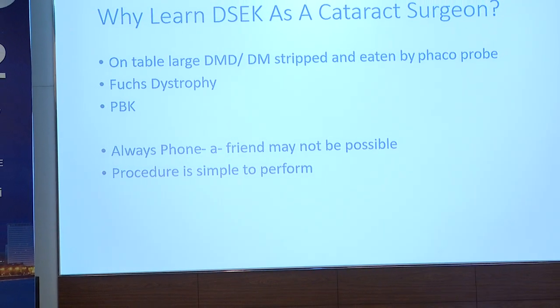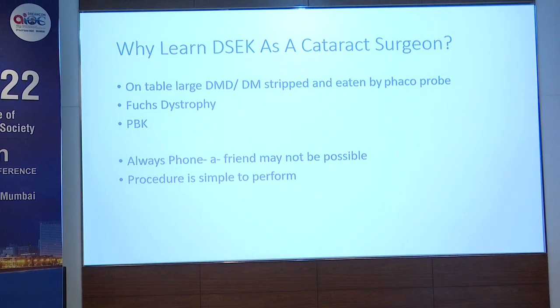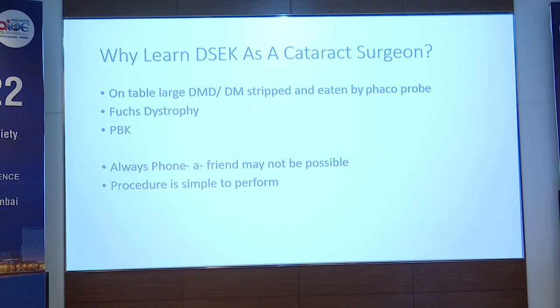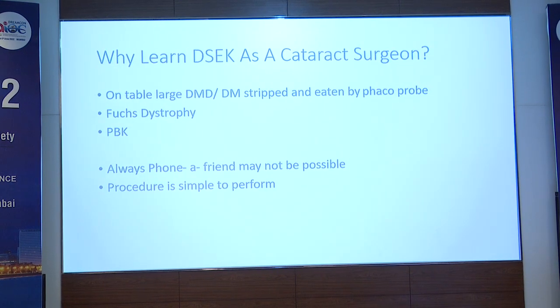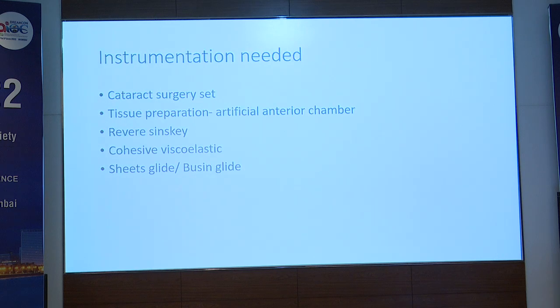So on table, a lot of times we see patients may have a large Descemet detachment, or sometimes the Descemet is just eaten by a phaco probe inadvertently. Patients may have Fuchs dystrophy, or your own patients may be having a PBK. And it's not always possible to call a friend to do the procedure when it's quite simple to perform.